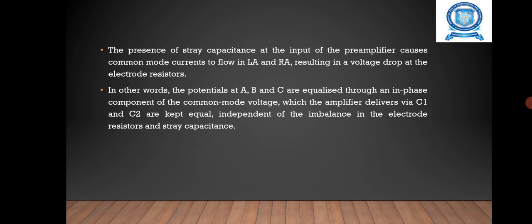Modern ECG machines with completely shielded patient cables and lead wires, and high common mode rejection, are sufficiently resistant to mains interference. There could still be locations where interference cannot be eliminated by reapplying the electrodes or moving the cable. Here the attenuation provided could be up to 40 dB. In this way the trace is cleaned up by the substantial reduction of line frequency interference.